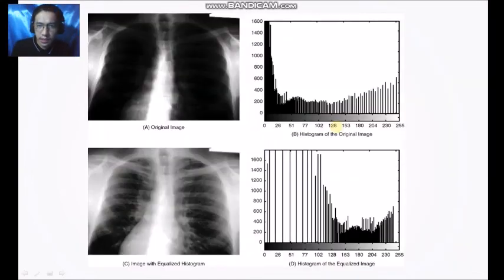Okay, so again, this is a histogram of the original image, and then an automatic scaling system, or the computer system of the CR and DR system, will automatically adjust the contrast and density of the images based on the examination that was required or that is set by the RadTech.